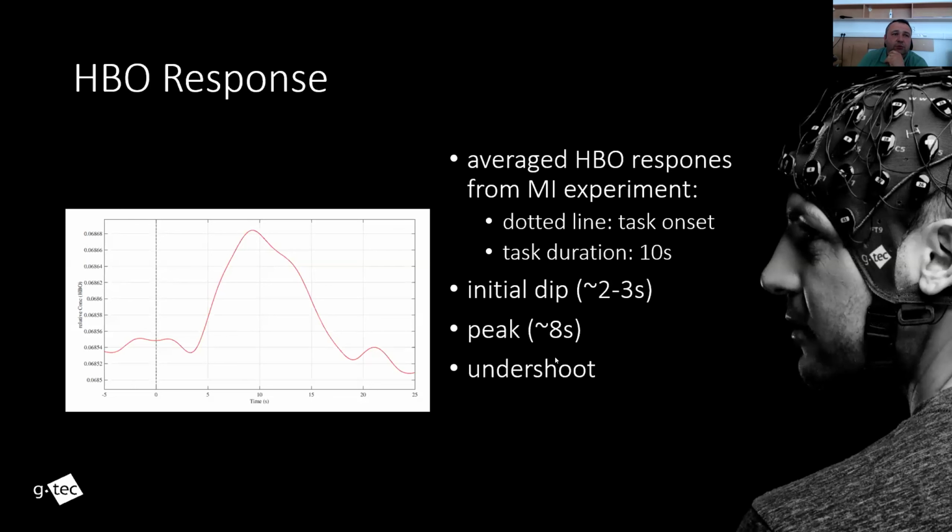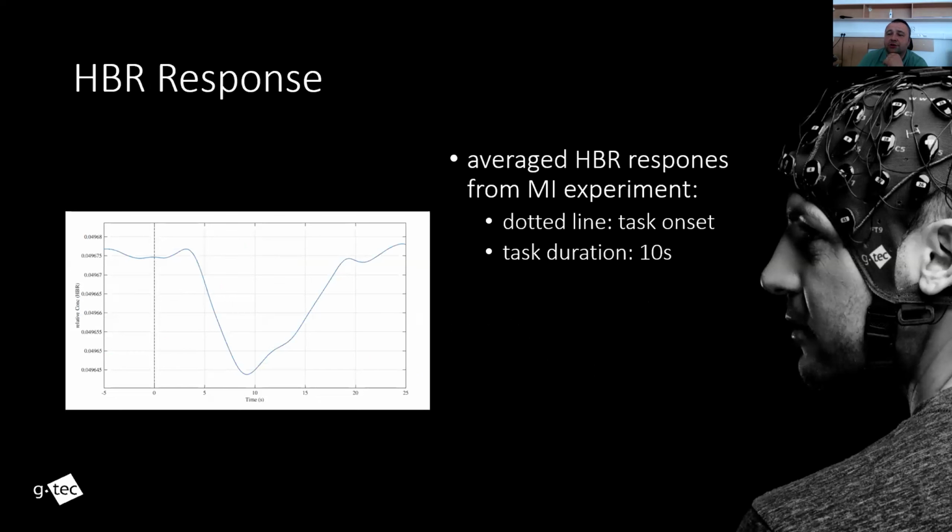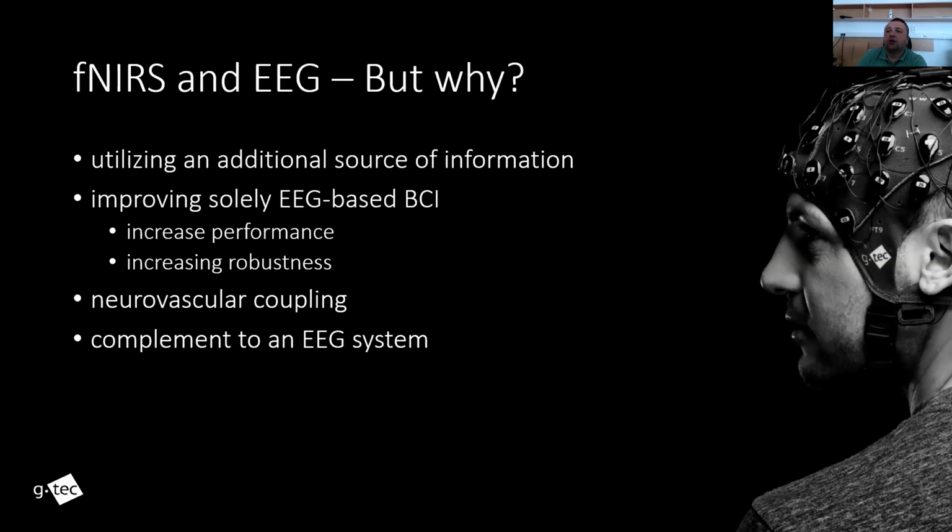In the same way, we can see the deoxygenated hemoglobin response for the same experiment. So again, the task onset, the negative peak in here at about 8 seconds, and again, the same task duration of 10 seconds.